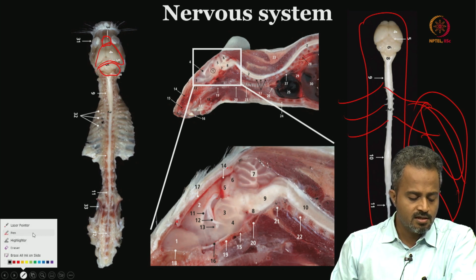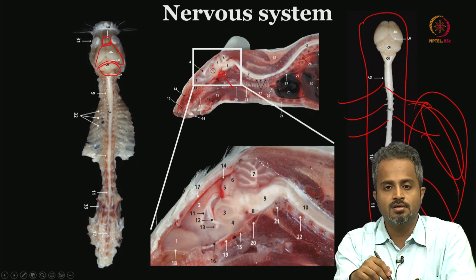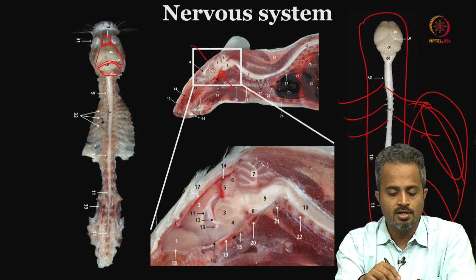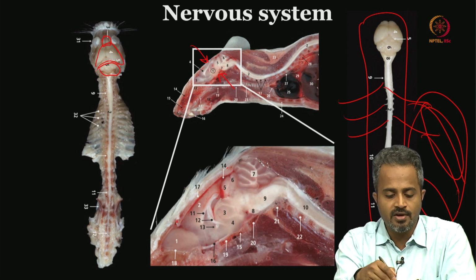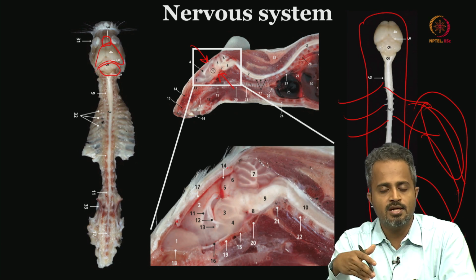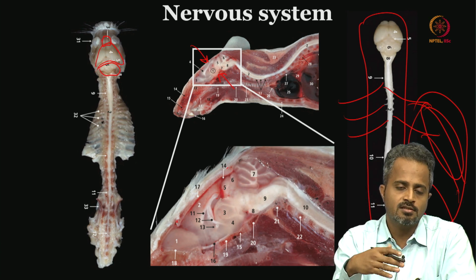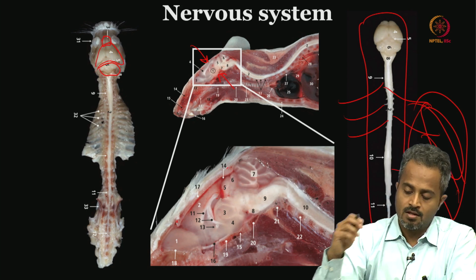So, that is the importance of this particular slide. You need to decide: are you going to extract it from below or from the top? That is very vital, depending on where the structure is that you are dealing with, which has to be dealt with at the end of your extraction, not in the beginning, because the structure is going to get damaged when we are handling the skull.